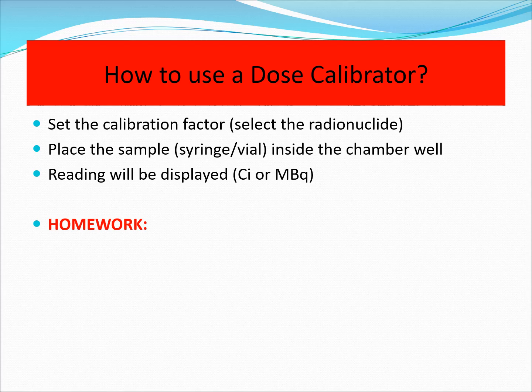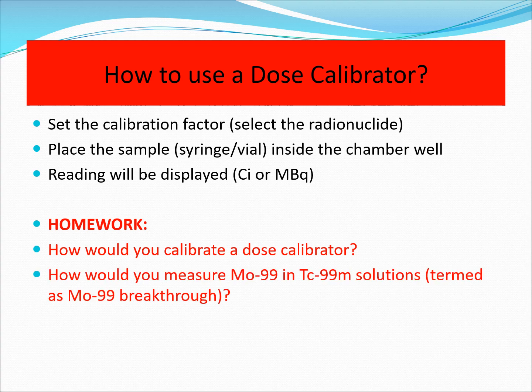So for some extra and required study as your homework, please check how you would calibrate a dose calibrator. Hopefully we can discuss this in our meeting tomorrow or in the next session, inshallah. And another task that I'm giving you is how would you measure molybdenum breakthrough or contaminant in the technetium-99m solution.